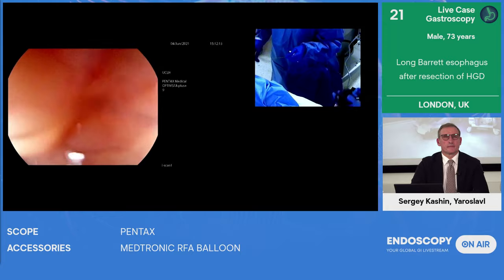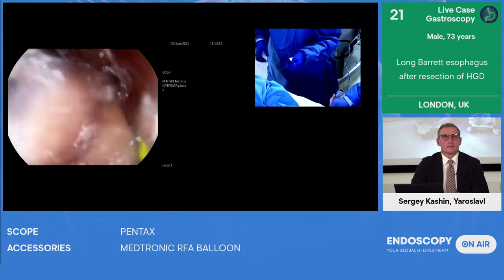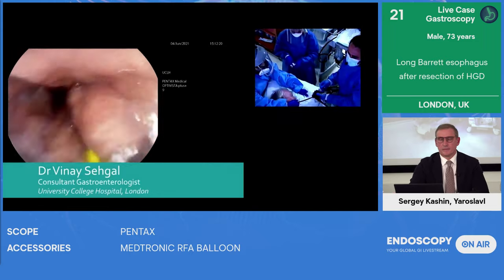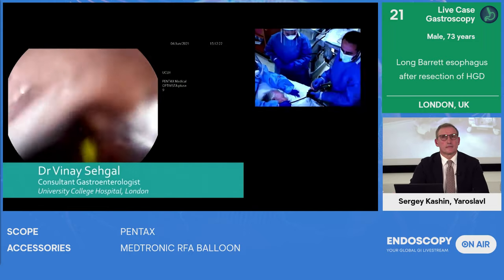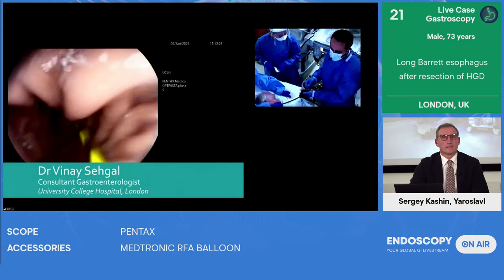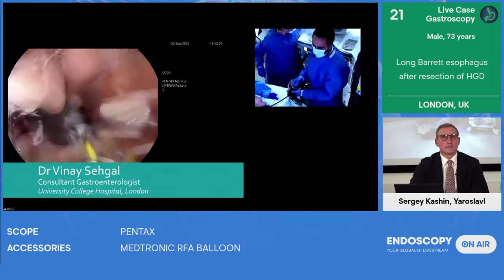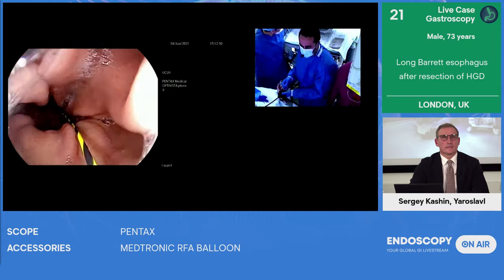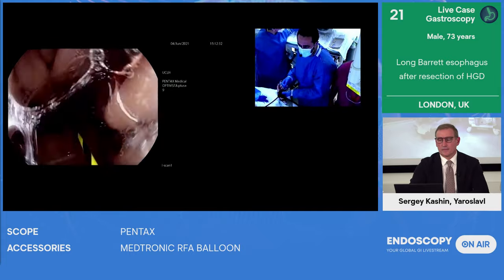So this is a gentleman who has a long segment of Barrett, 16 centimeters. He's had a previous EMR, which has revealed high-grade dysplasia. So he's come back for a reassessment with the aim of ablating his long segment of Barrett that he has left. Before you came across to me, I'd already inspected the Barrett's to make sure there were no visible lesions so that it's safe to proceed with RFA.